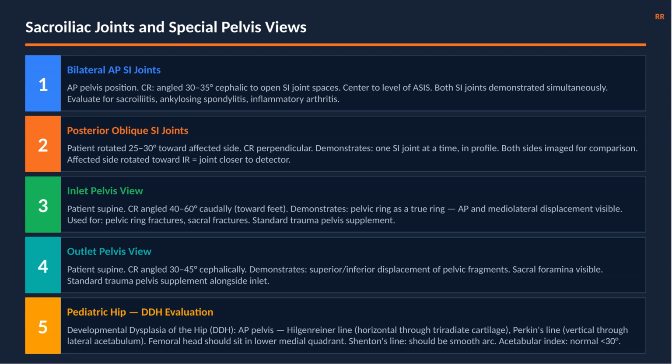Posterior oblique. Patient rotated 25 to 30 degrees toward the affected side. CR perpendicular. Demonstrates one joint at a time in profile. Both sides imaged for comparison.